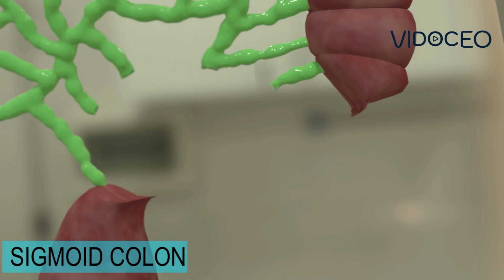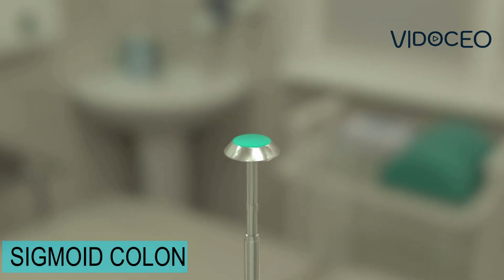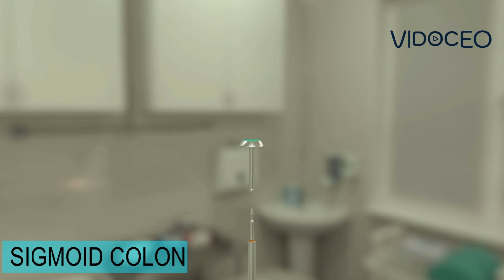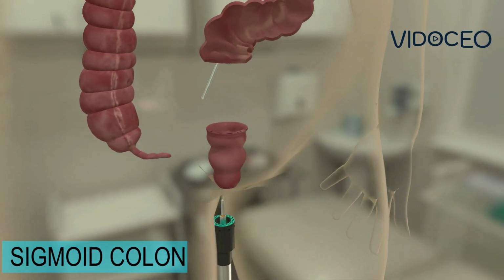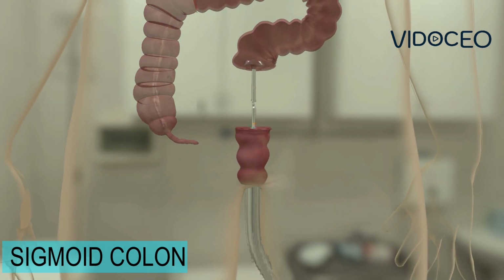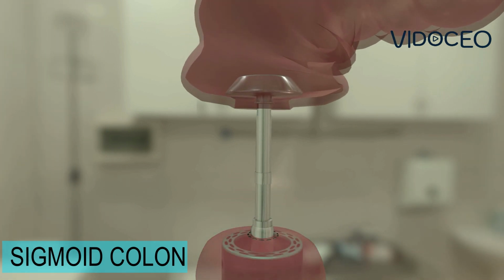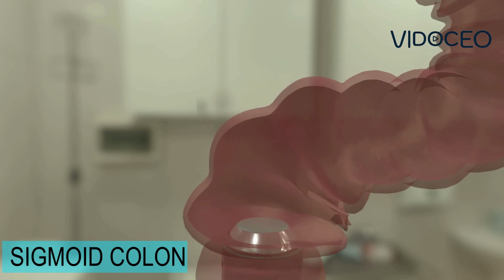To reconnect the colon to the remaining rectum, a round stapling device is used by the surgeon to attach two pieces of bowel together using small metal staples. The top of the device, called an anvil, is placed into the upper portion of the colon. Then the handle of the stapler is brought through the bottom and into the rectum. The two ends of the stapler are attached, and the stapler is fired to make a round reconnection of the bowel.